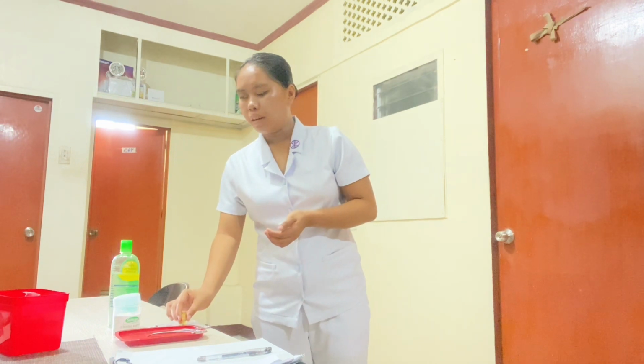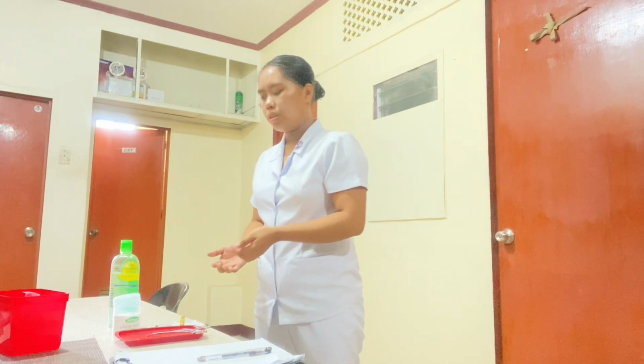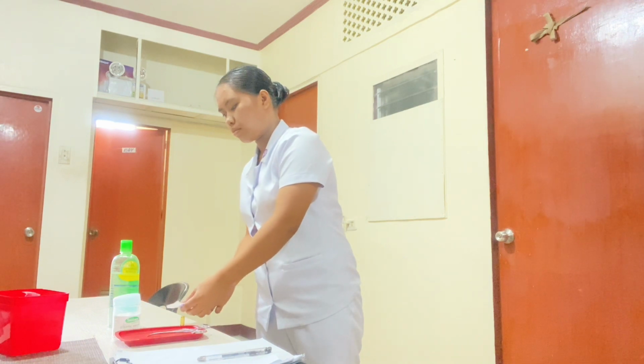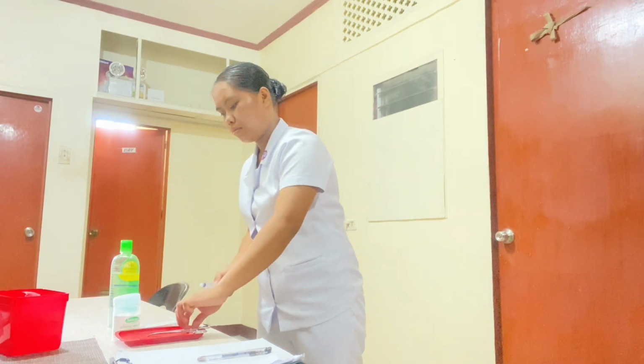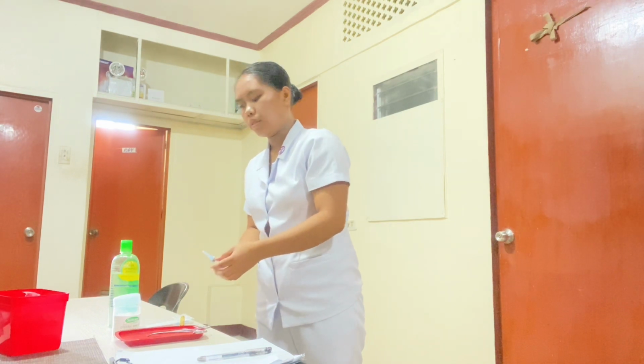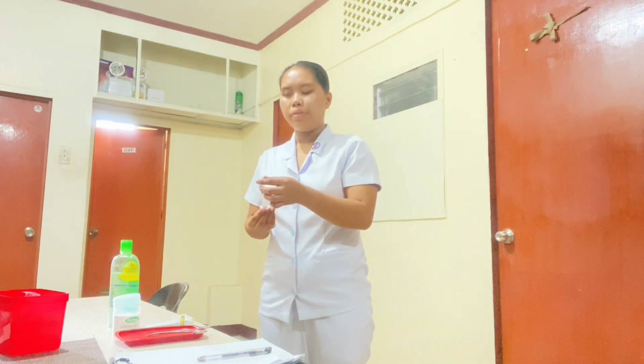And now, for the withdrawal of medication, place the ampule on a flat surface. Attach the filter needle to the syringe. Then remove the cap of the needle.